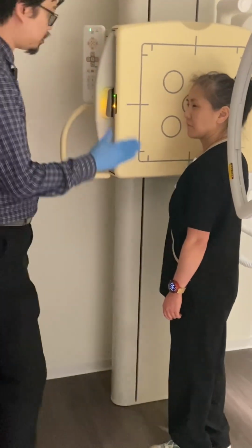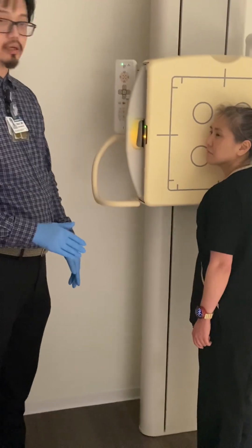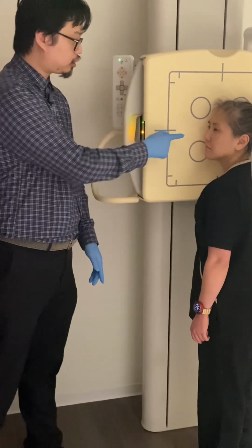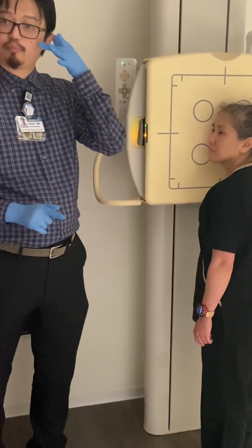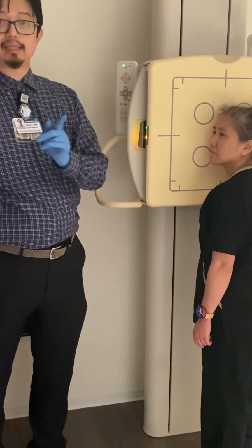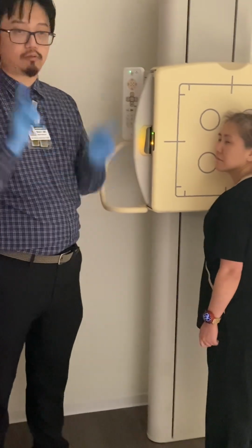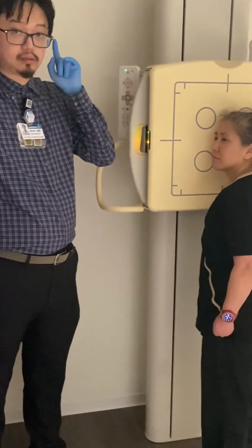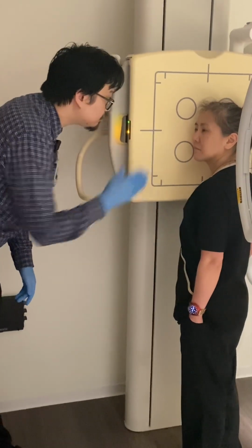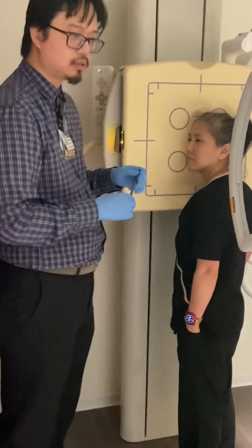All right, so first of all, touch your ear to the board. Good. Do not touch the ear and cheek to the board. The head is slanted. If both of these are touching, your head is rotated. Only the ear should be touching, right? Because the cheek is narrower than where the ear is. Make sense? Okay, so ear touching. Good. Let's take a look.